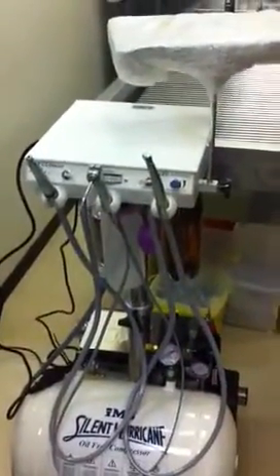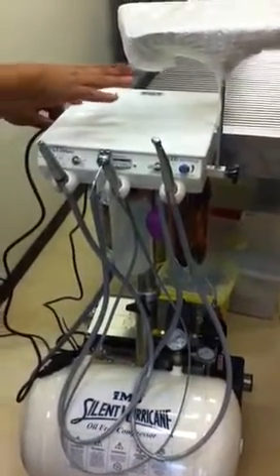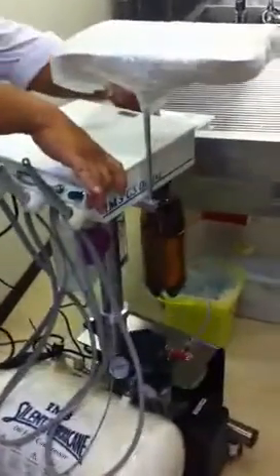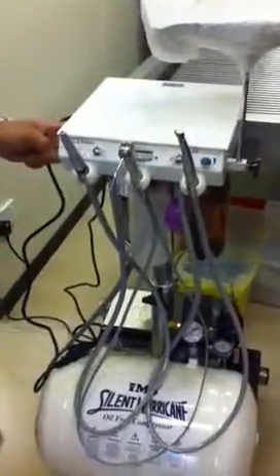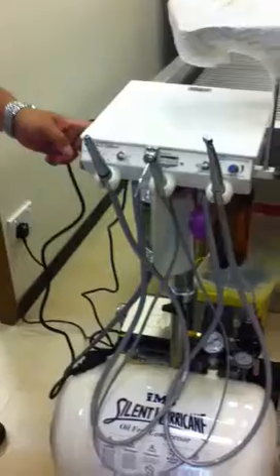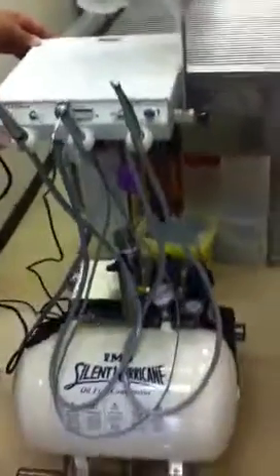Then moving on to the head unit itself. iM3 uses a direct AC socket, and you can actually parallel if you have the scaler. Your scaler would be connected directly to this water source, and then it can be powered through here. Oh, you mean the iM3 scaler? Okay.